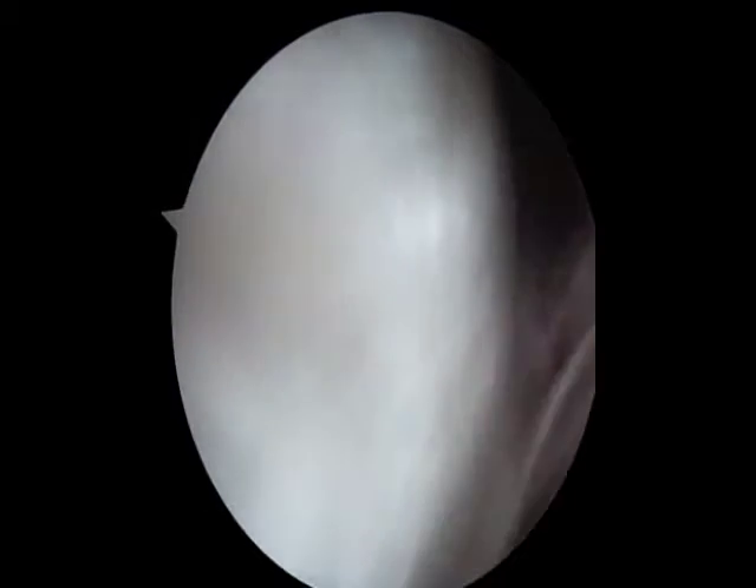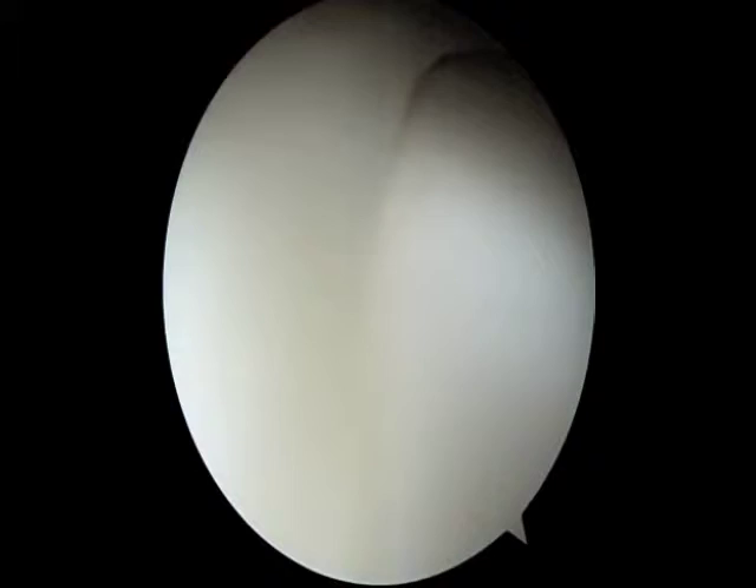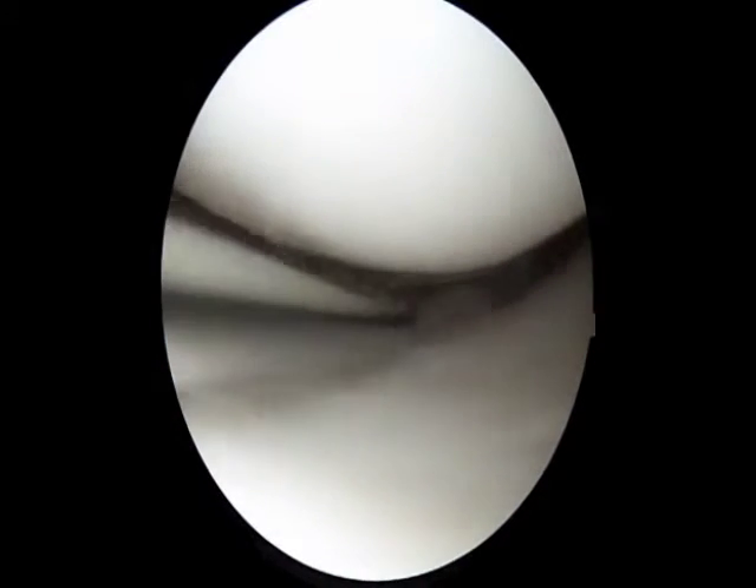Coming back up and across the knee to the medial or inner side of the knee, a probe is inserted and this is used to assess the articular surface and the meniscus, which is seen on the left hand side of the screen.